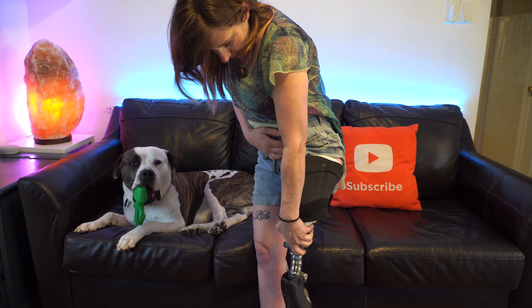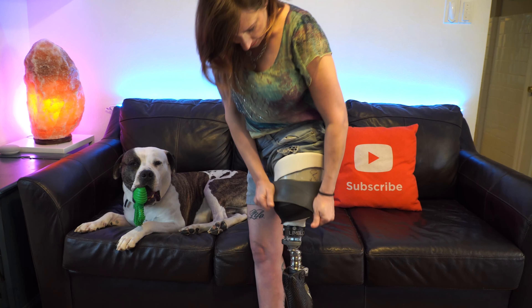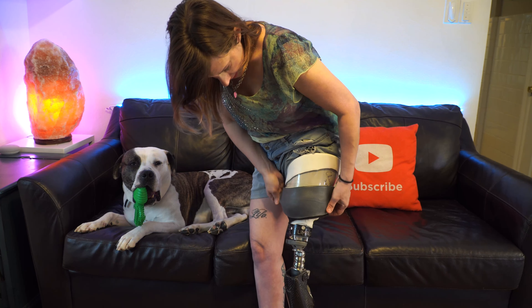It's been four and a half weeks since I got my residual limb revised, removing two pounds of excess skin and tissue that was on the end of my residual limb, and look — I'm wearing a prosthetic leg again. I am wearing a check socket. A check socket, if you don't know, is a socket that is meant to check for fit — it's not meant to be a permanent socket.